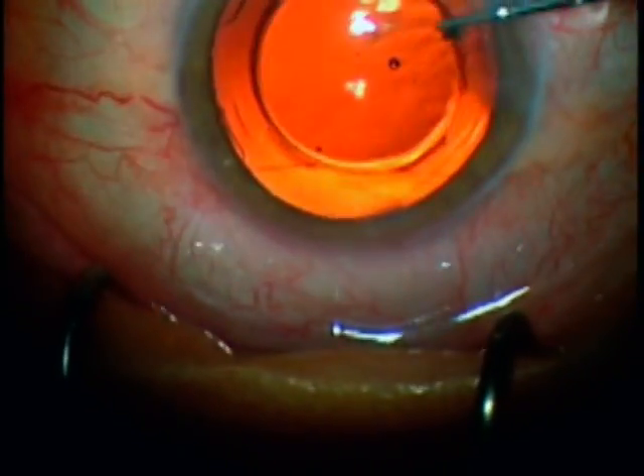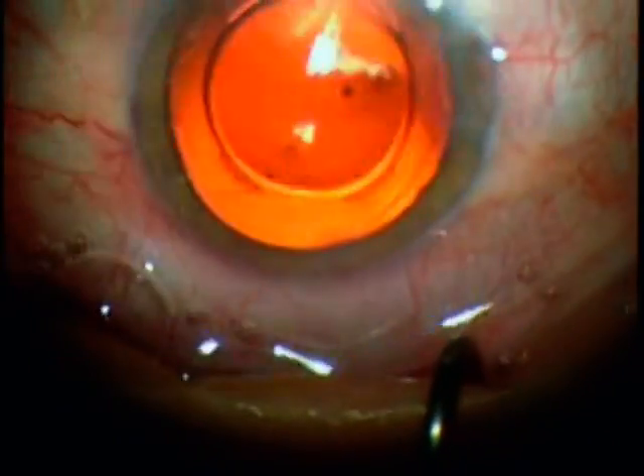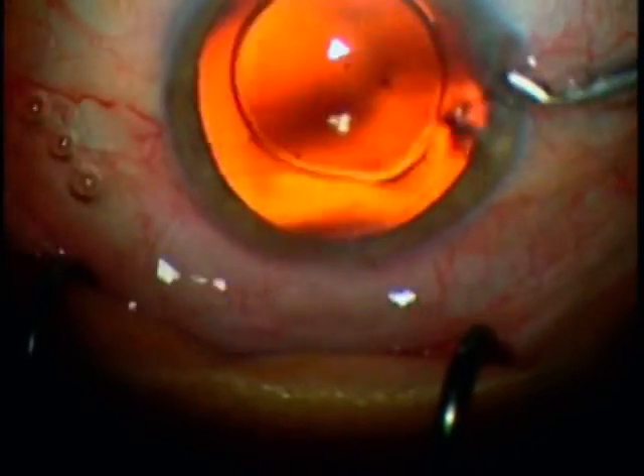The lens centers automatically, and as you can see, the material is completely clear and completely homogeneous.